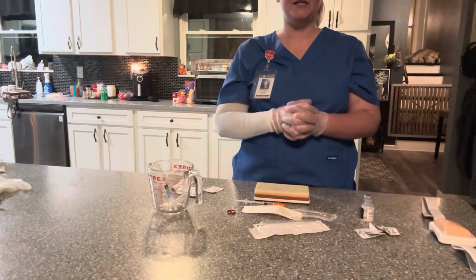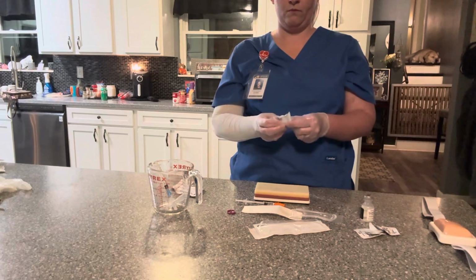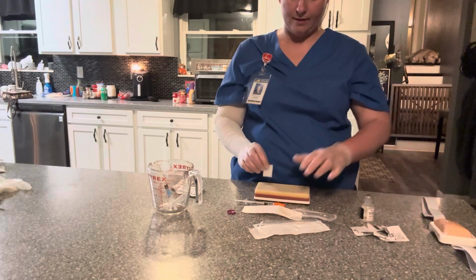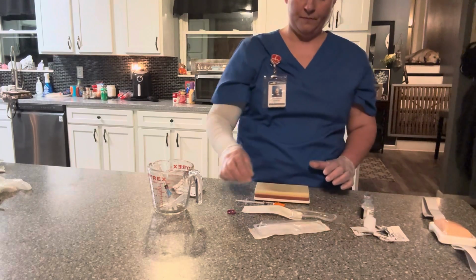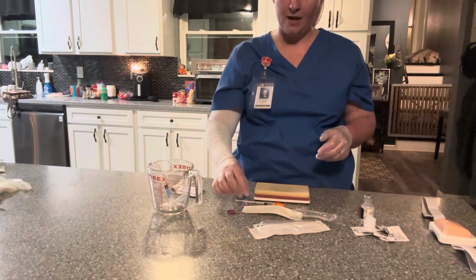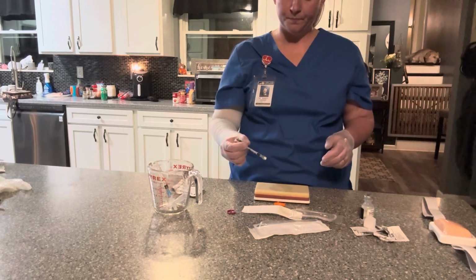For giving the subcutaneous injection, I will cleanse the abdominal site from the inner to the outer. This is given at a 45 to 90-degree angle, depending on the amount of subcutaneous fat. For this video, I'll be giving it at a 45-degree angle.